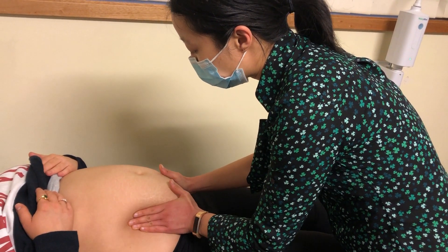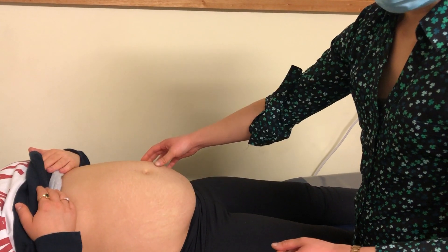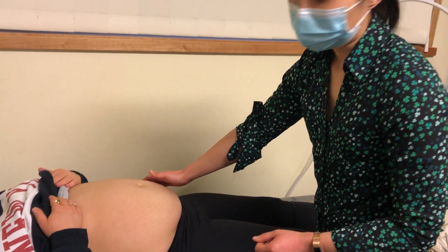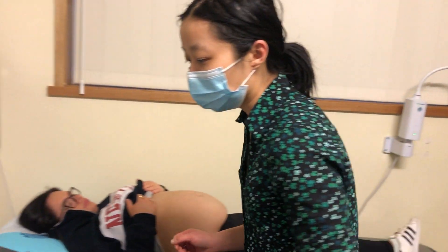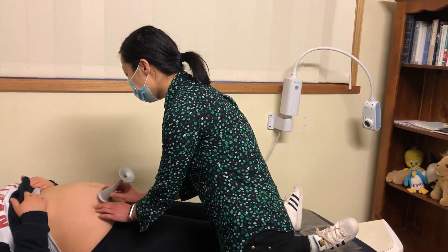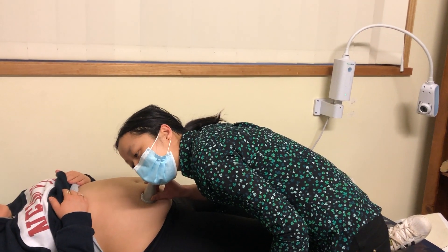From the palpation it's likely going to be generally in this location or this location. For her at the moment the fetal back is probably a bit more posterior, so we're going to have a check with the stethoscope. With the Pinnard stethoscope, you apply it over the shoulder and then have a listen.